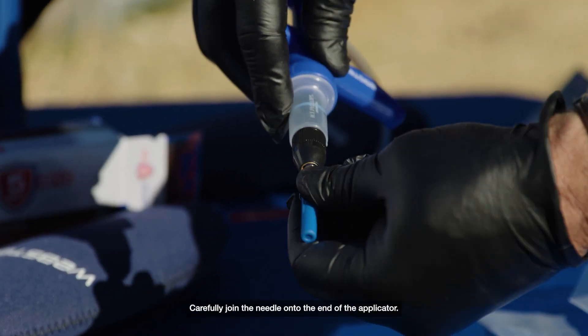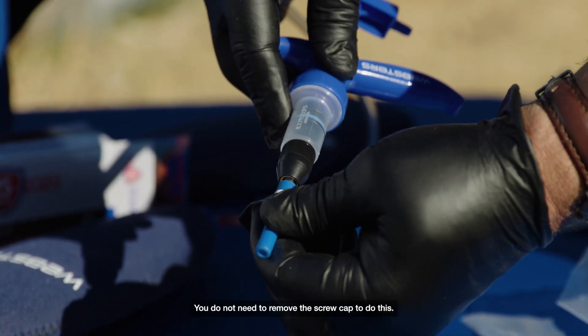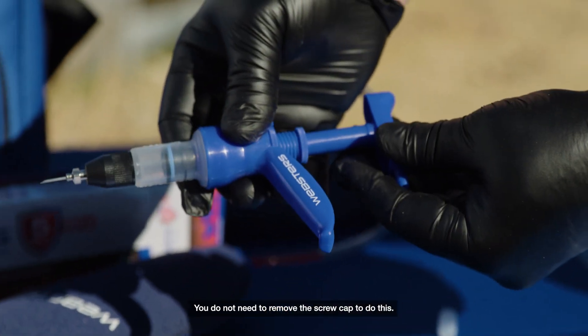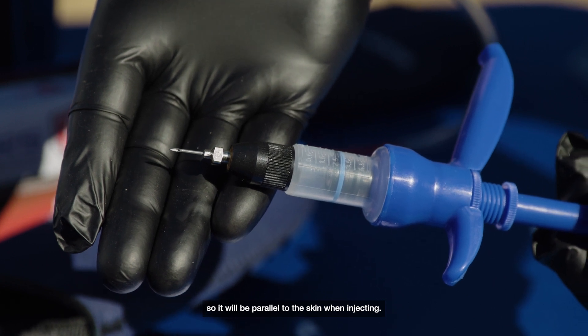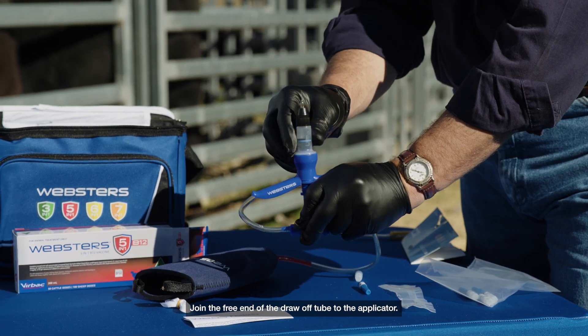Carefully join the needle onto the end of the applicator. You do not need to remove the screw cap to do this. Line up the bevel of the needle so it will be parallel to the skin when injecting. Join the free end of the draw-off tube to the applicator.